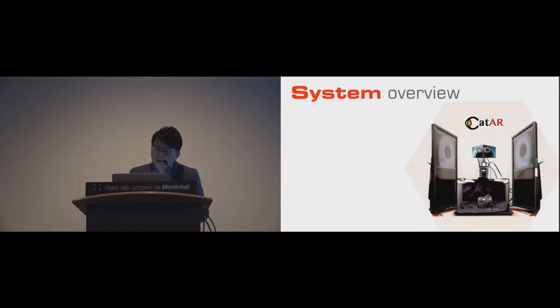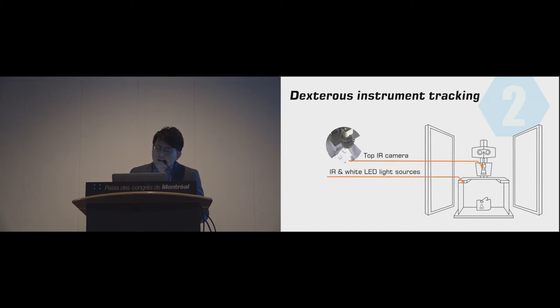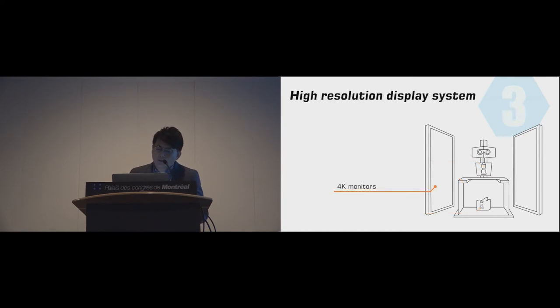Implementation. CATAR has three main parts: video see-through AR platform, dexterous instrument tracking, and high-resolution display system. In video see-through AR platform, we build realistic mannequin and eye model on the table. Above that, we set the stereo microscope camera module to capture the real images. For dexterous instrument tracking, we use only two sets of infrared cameras and light sources. One is beside the microscope module, and the other is under the eye model. After the real and virtual images are composited, the final images will be displayed on a pair of 4K monitors, and be reflected into the eyepiece by mirrors.